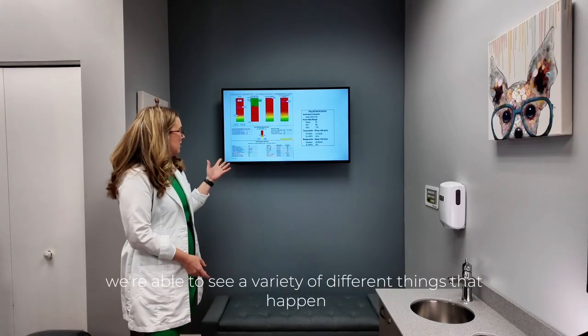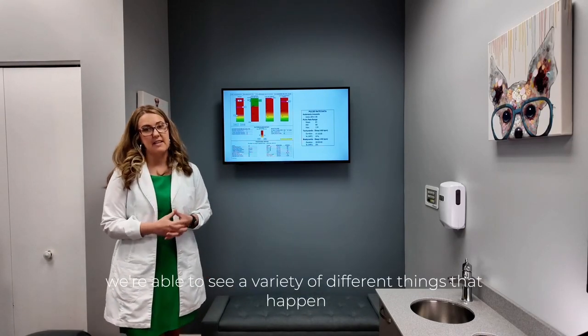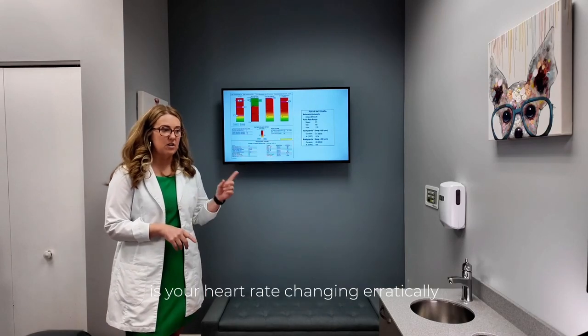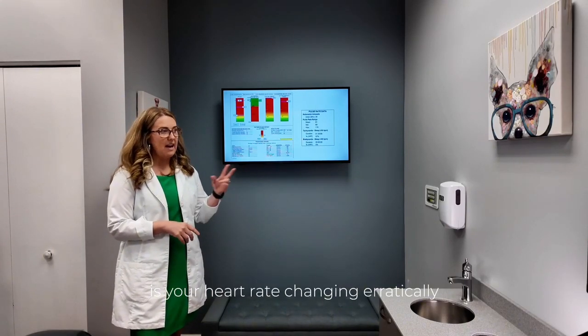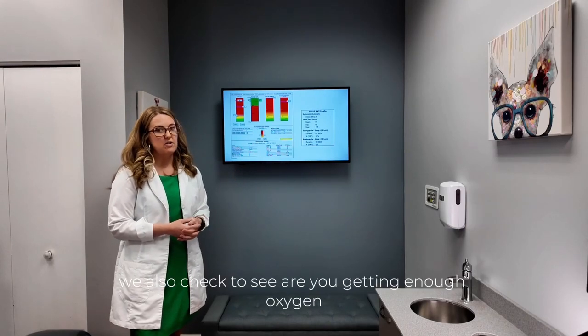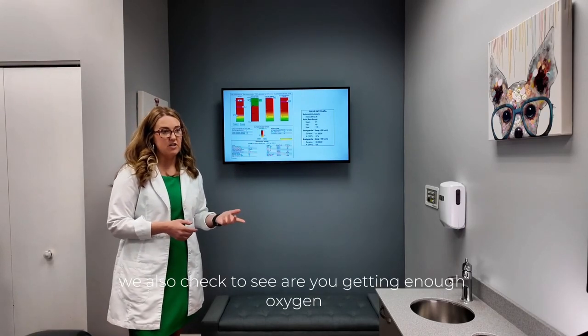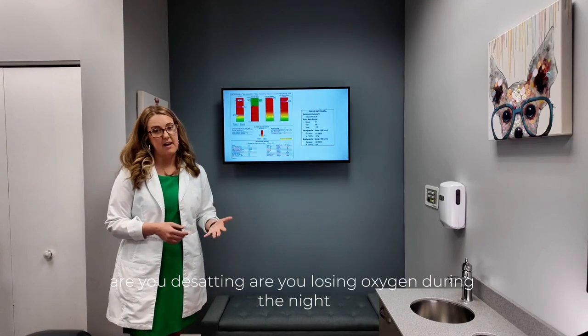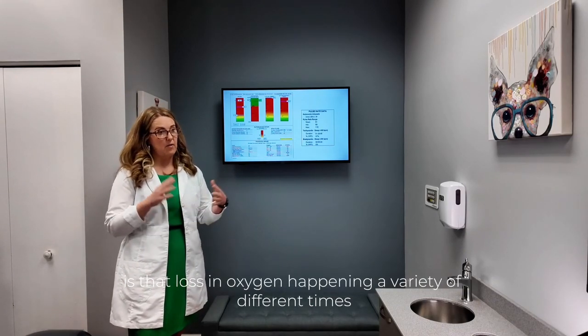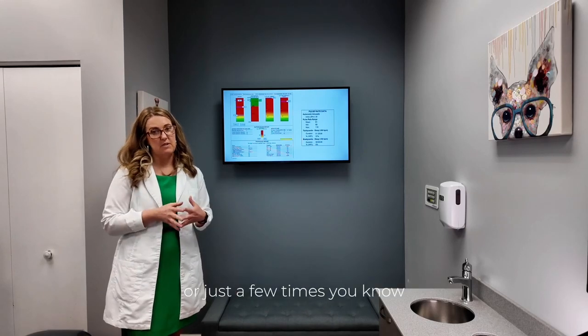From this oximeter, we're able to see a variety of different things that happen when you sleep. We look to see, what is your heart doing? Is your heart rate changing erratically? Is your heart rate elevated or too low? We also check to see, are you getting enough oxygen? Are you desatting? Are you losing oxygen during the night? Is that loss in oxygen happening a variety of different times or just a few times?